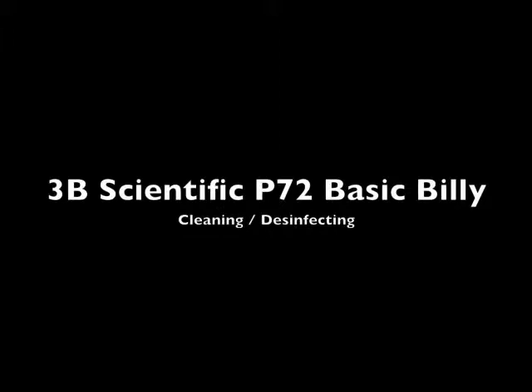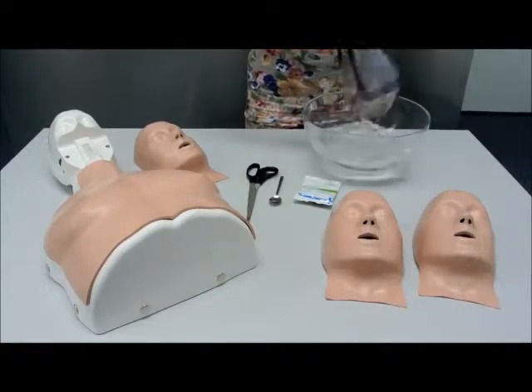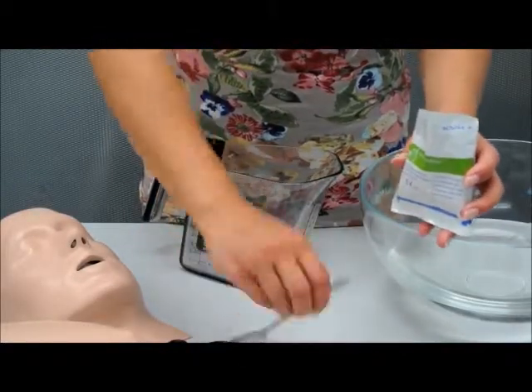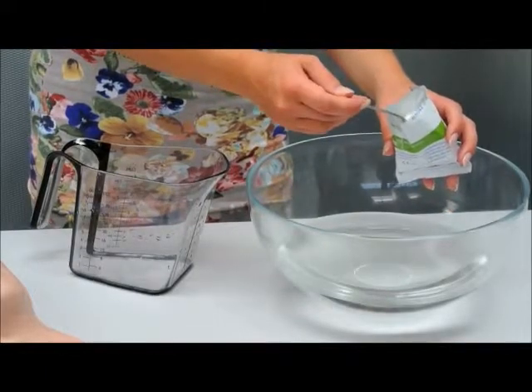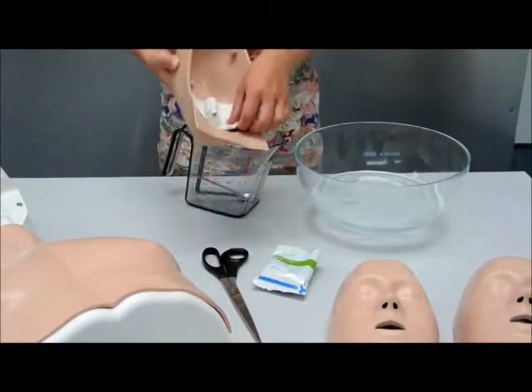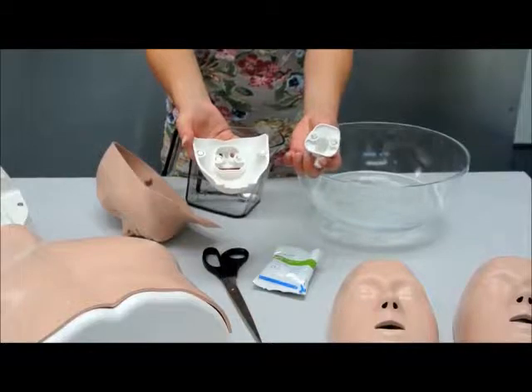Cleaning and disinfecting Basic Billy. Add cleaning solution to warm water. Place the lung bag socket, jaw insert, and face skin into the soapy water.